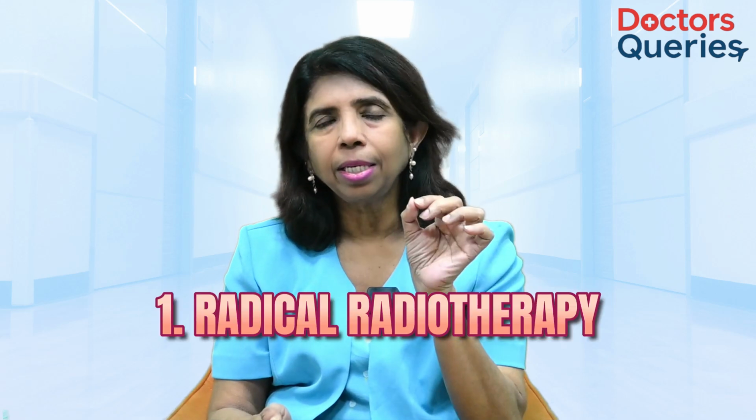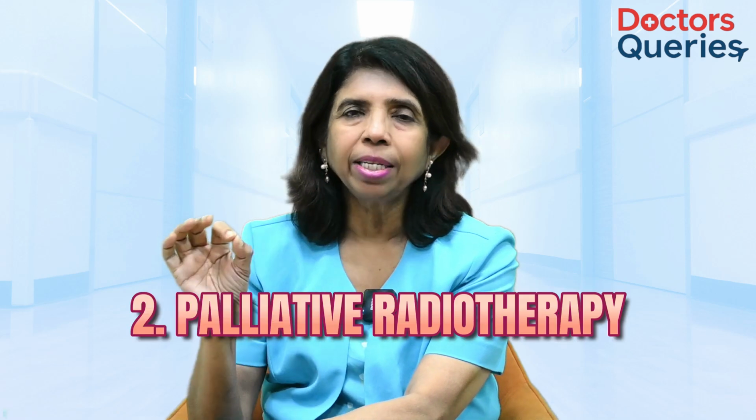When a patient has been planned for radiation therapy, this radiation therapy can be of two intents. One is a radical or a curative intent. Second is a palliative intent, which is given for an advanced stage disease. But whatever the intent is, the method of treatment is the same. So how do we treat with radiation treatment?